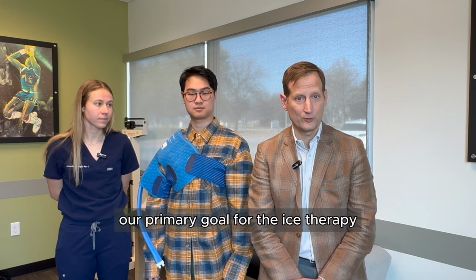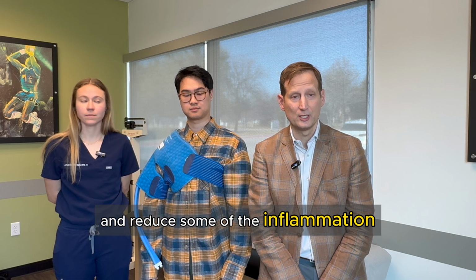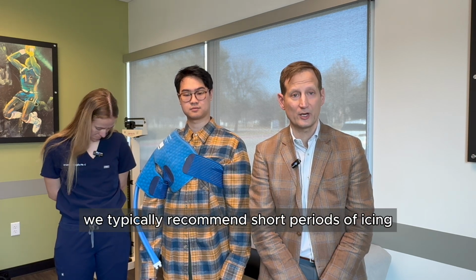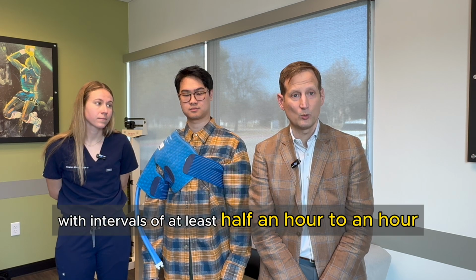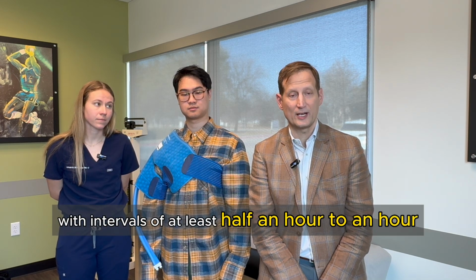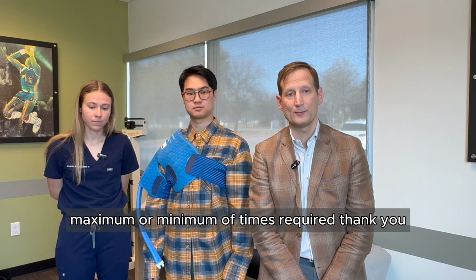Our primary goal for the ice therapy is to help relieve pain and reduce some of the inflammation. We typically recommend short periods of icing, usually 15 to 30 minutes at a time, with intervals of at least half an hour to an hour in between icing sessions, with no absolute maximum or minimum of times required.